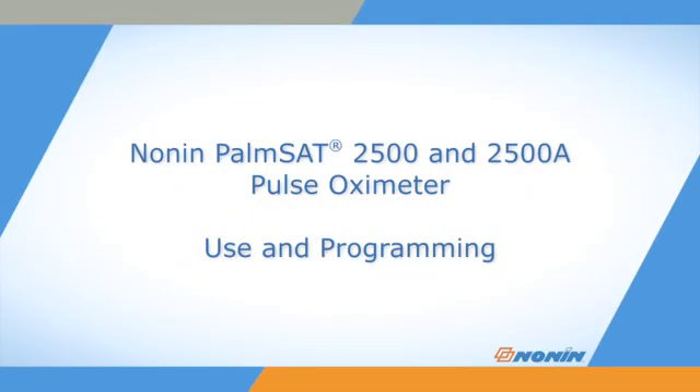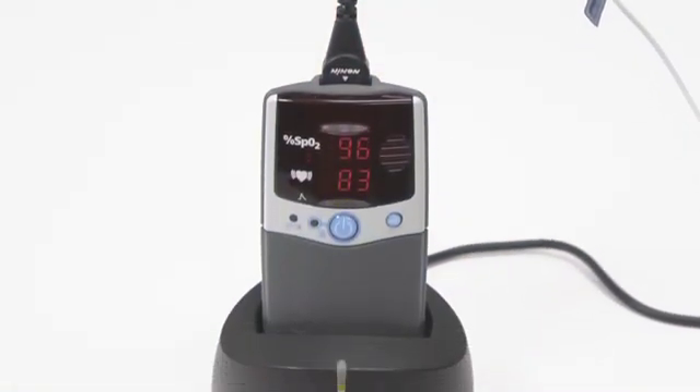This short video shows how to properly program, connect, and operate Nonin PalmSat Model 2500 and 2500A pulse oximeters.